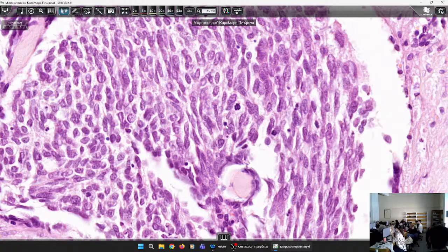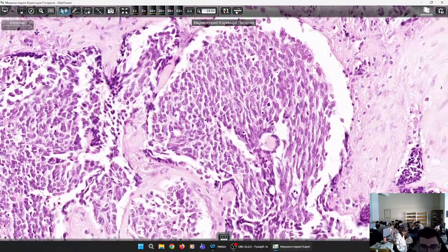Excellent. Because if a tumor has a high apoptotic potential, as shown by the multiple apoptotic bodies of small cell carcinoma, you can give drugs that further induce apoptosis and destroy the vast majority of neoplastic cells.